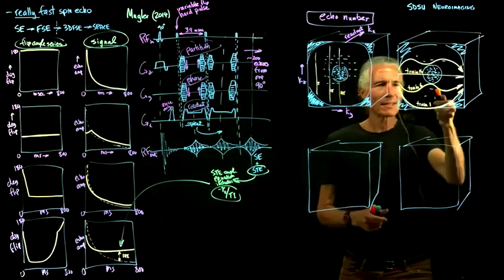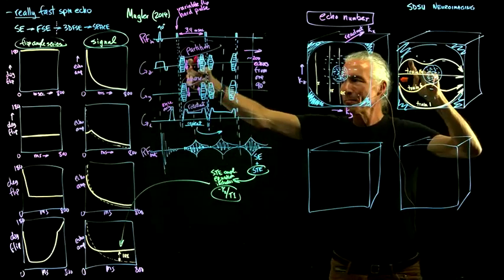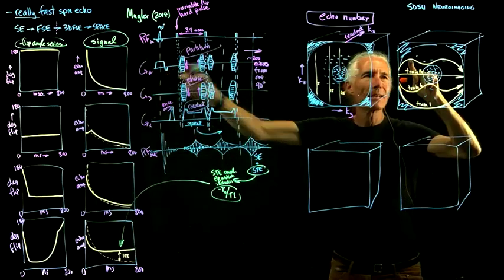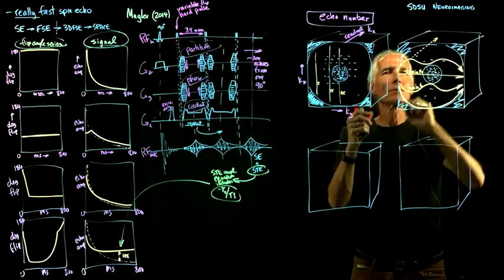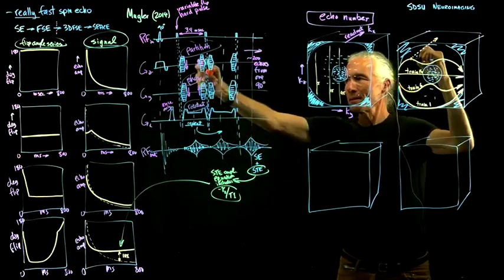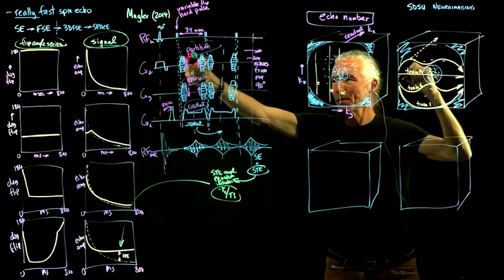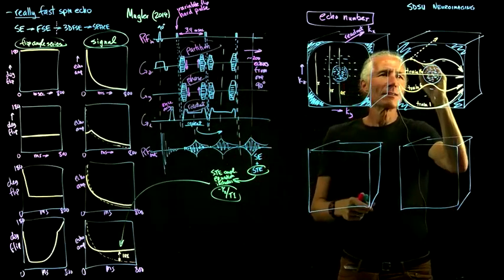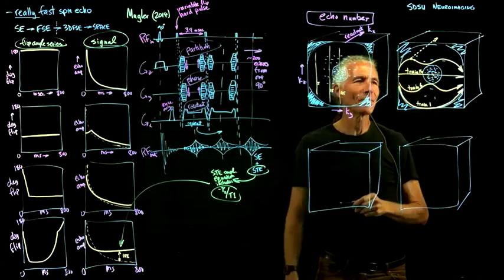And what does this mean here? This means, how do you get to a particular point here? It's some combination of these two guys, the Z and the Y gradient, and then you record data, you do a readout at that point, and then you undo whatever you did, and then set them to another thing. So you can see you're not going through in the straightforward way here, because you're making the KY go up and then making it go down, complicated mess.